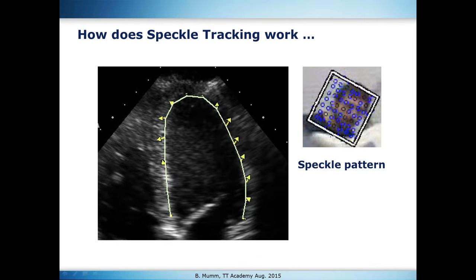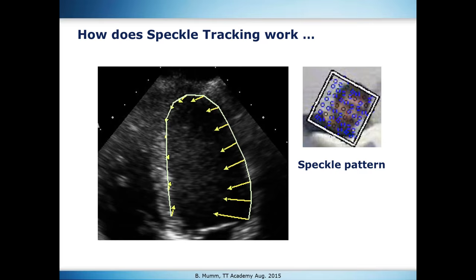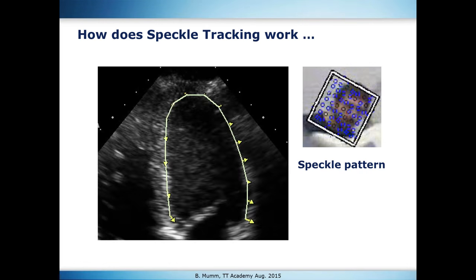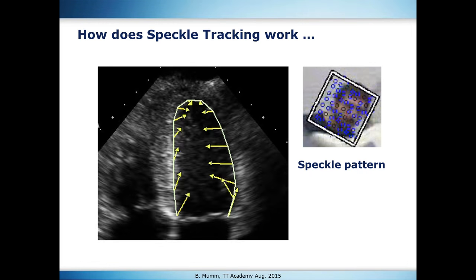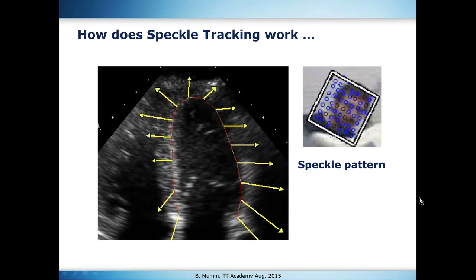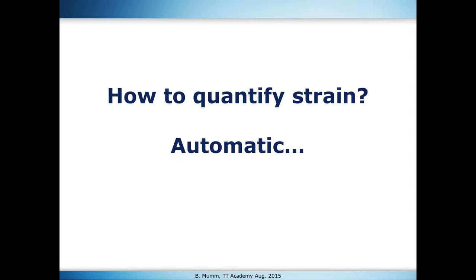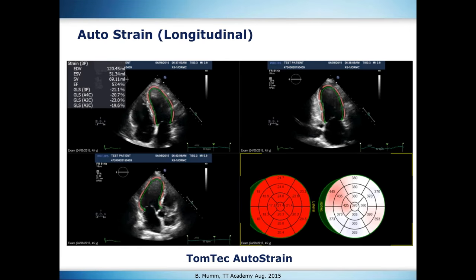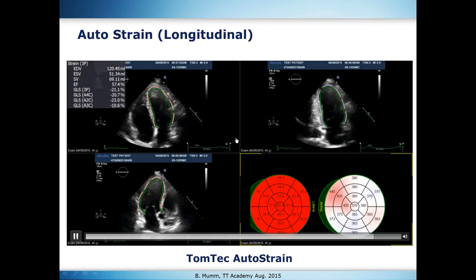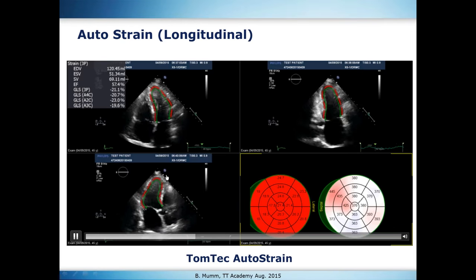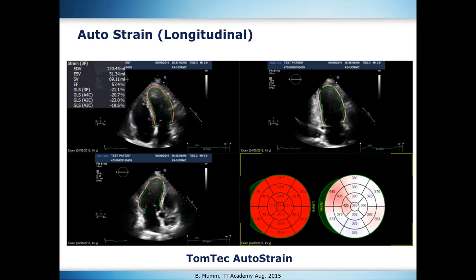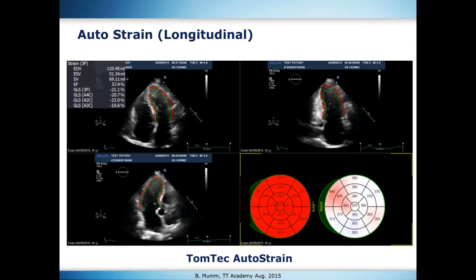This is applied not only to one sample but across the entire length of the endocardium as seen in this four-chamber view. Yellow arrows indicate the direction and speed — the length of the arrow represents the speed of the myocardial wall motion. We can visualize and quantify it based on speckle tracking. Let me show you our latest technology to quantify global longitudinal strain based on three long-axis views: the four-chamber view on the upper left, the two-chamber view on the upper right, and the three-chamber view on the lower left. With just three mouse clicks, the software can automatically quantify global longitudinal strain.